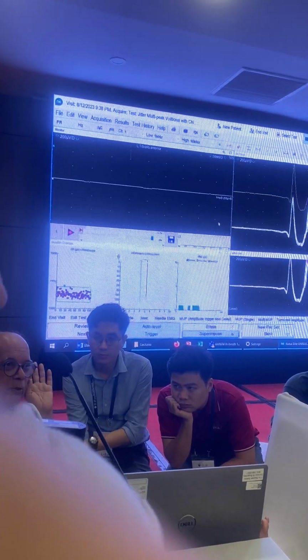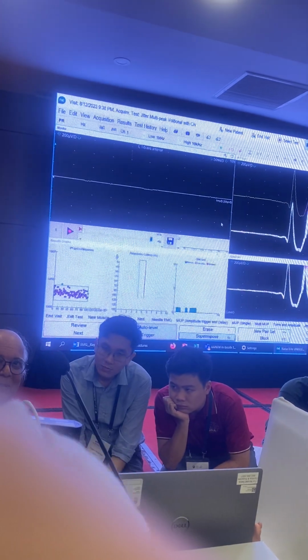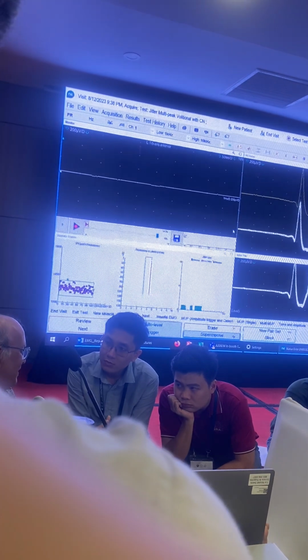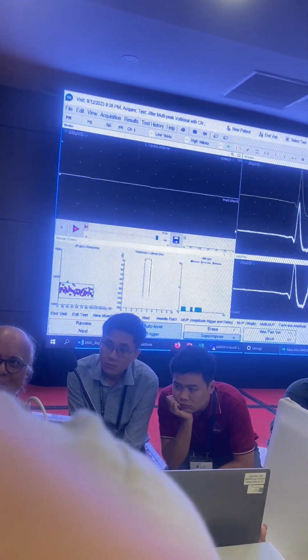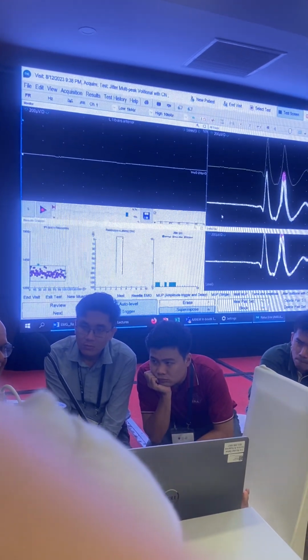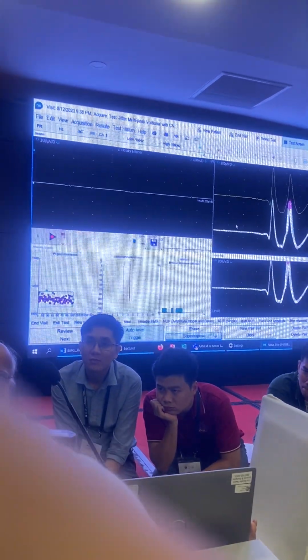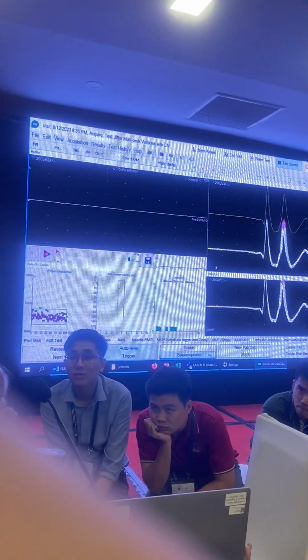And again, as I said, see, I am old, so my tibialis anterior is very easy. Patients are not easy. So start like this, then you can go to patients and doing reversals. Okay? This looks too easy, right? Myasthenia is much more difficult when you start doing it. Okay.